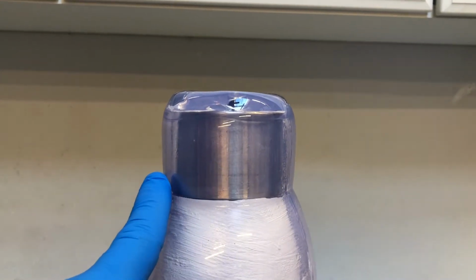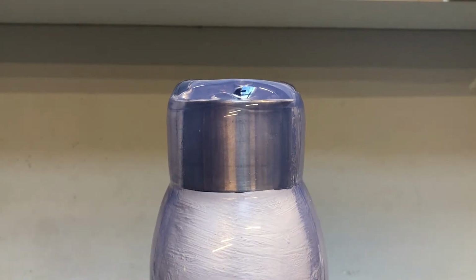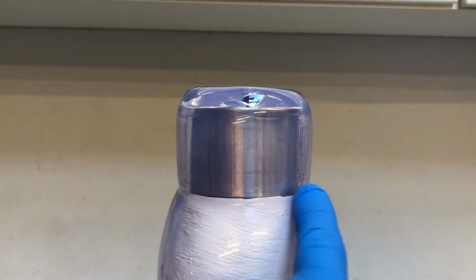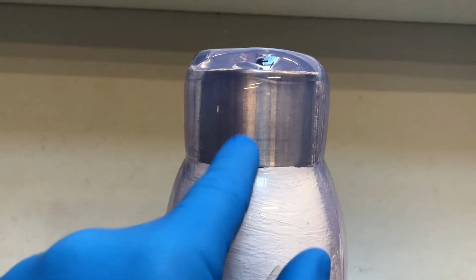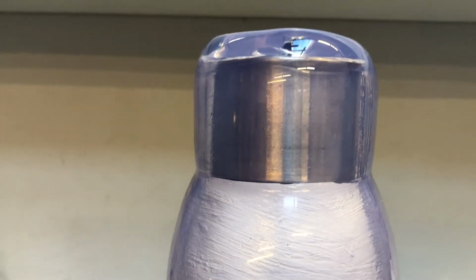Ensure the plastic pull conforms perfectly around the molding dummy in the red zone, which is from the scribed line down to the plaster model. Perfect contact here is critical, as this is where your puck seal will sit.